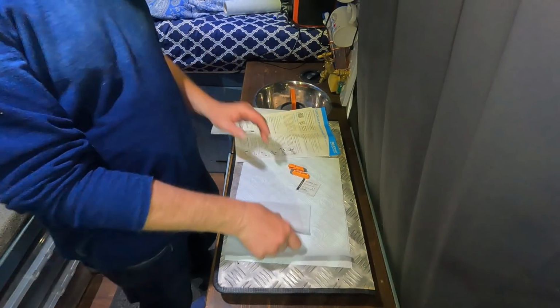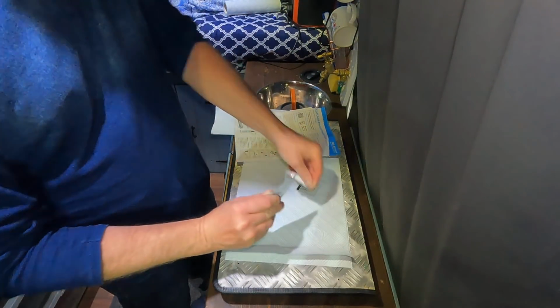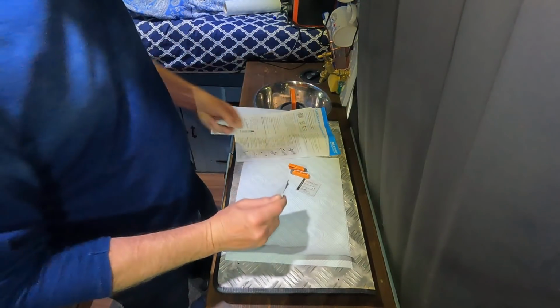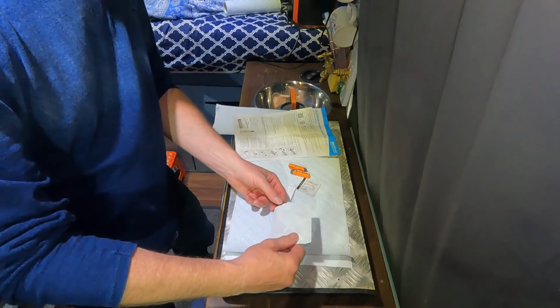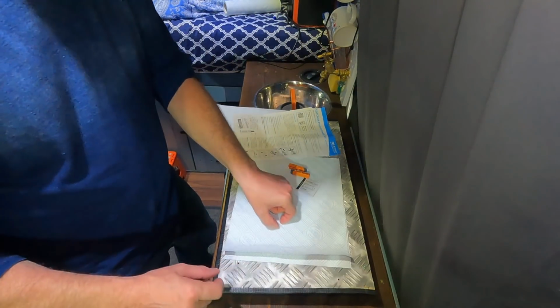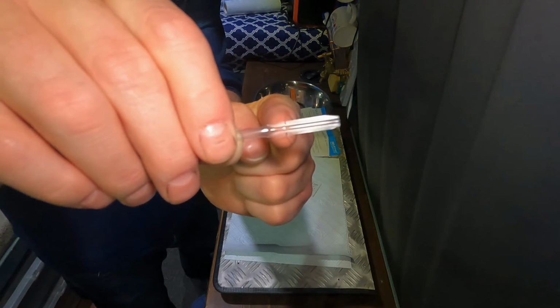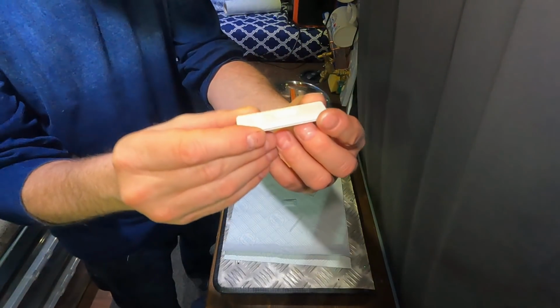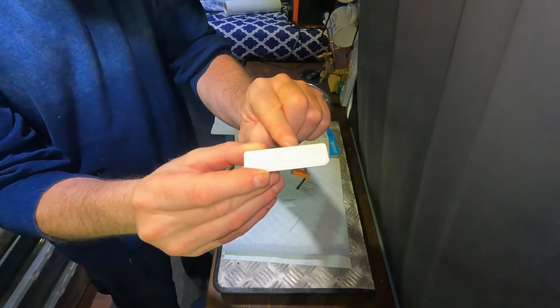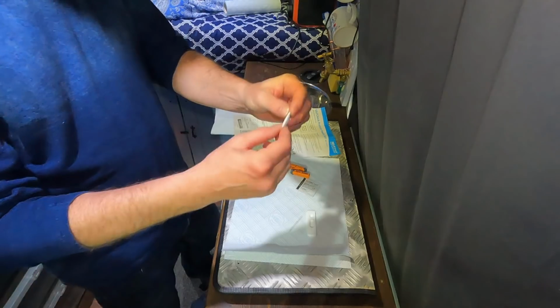Okay, so the first stage is to prepare the testing kit by opening this up and have it laid out in front of you, it says. I'm just going to throw the rubbish down there. So in here we have all the little bits we need. This is a tube. I need to get blood in this tube up to this black line. This is the actual testing kit, the actual tester. It's got two marks, a T and a C. We'll go more into detail on that in a minute. Don't know what that is. Oh, that's a silica bag. Right, okay, we don't need that.